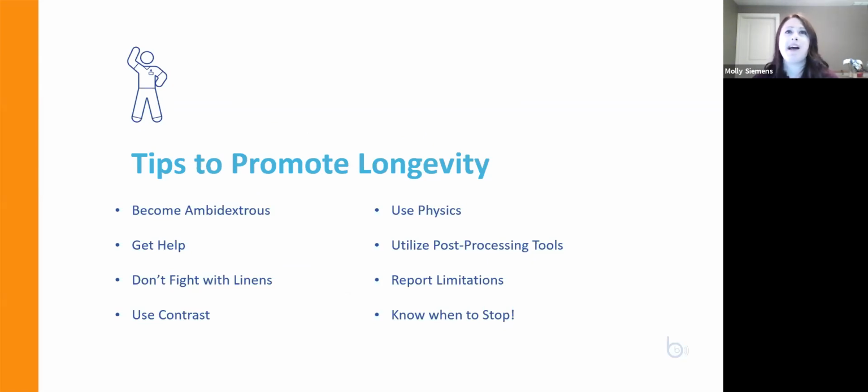Getting help, advocate for excellent teamwork. Have a fellow sonographer or a student assist when adjusting a patient's pannus for OB scans. Have another staff member assist with running the machine when performing mobile studies. Assistance isn't a detriment. It shows that you're caring for your patients while also protecting yourself and your coworkers.